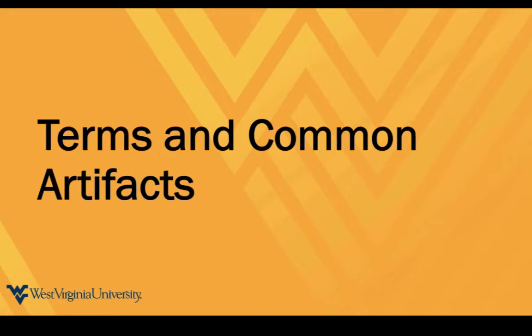We'll just barely touch a little bit into documentation, safety, disinfection, and then we'll do a really quick overview of what just some basic tissues look like. And then we'll finish it all up with a quick introduction on how to incorporate the ultrasound information that you get clinically into caring for the patients in front of you at the bedside. Let's get started.